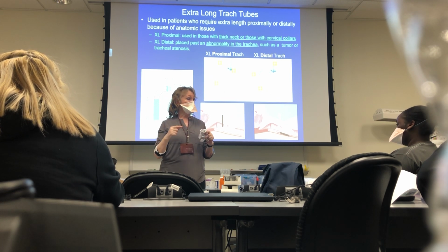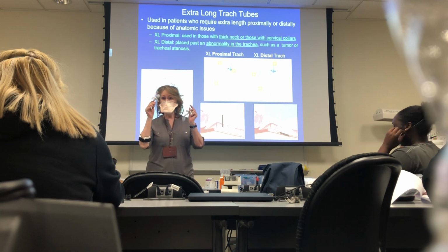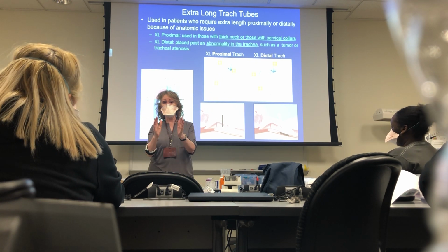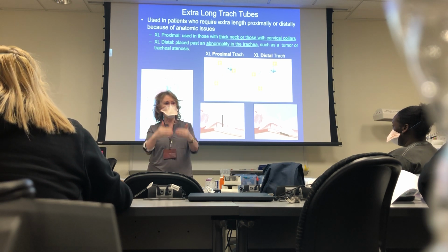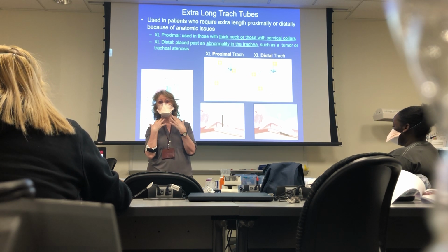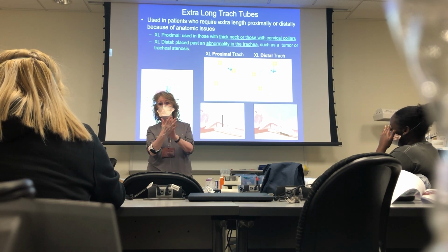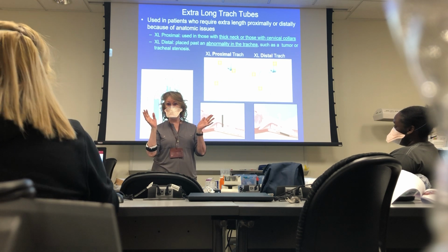So the proximal would be used with somebody who is leaking constantly. That's the only time you would consider these. If you have a major leak and your pressures are getting higher and higher in the cuff, you can obviously see this is a large person. We may need an extra long proximal. They have to be specially ordered. They're more expensive. They put that in, the leak goes away, you no longer have problems.